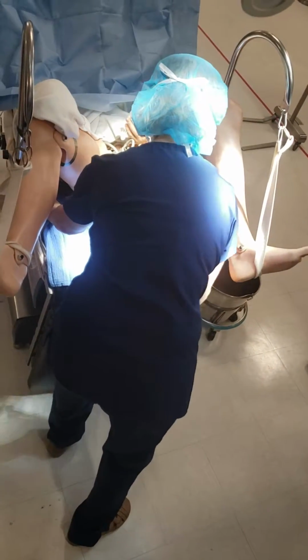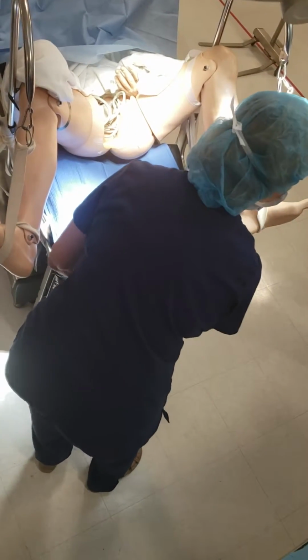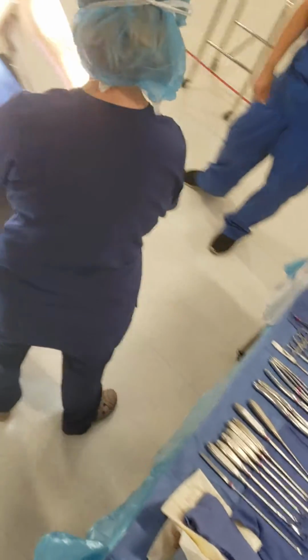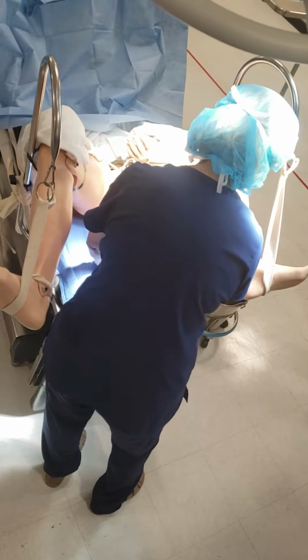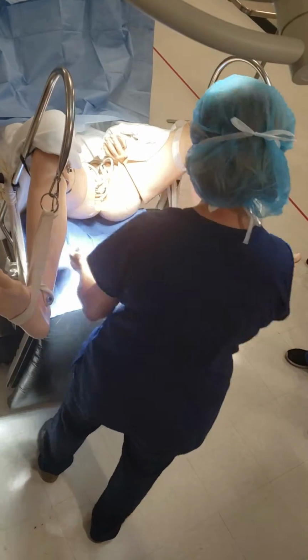They have tables now, most of the OR tables, these are two pads. And then the bottom half and the pad come off at the same time, and you put it underneath here so the butt remains right at the edge. The butt should be over here, but this is just old. And a Jackson table is for neuro, right? Yeah.